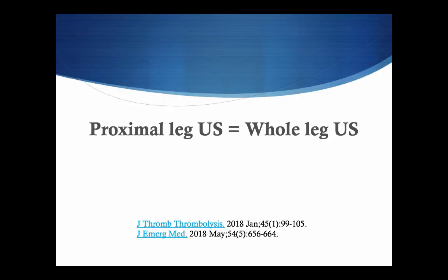It's pretty evidence-based. So one thing that both of these guidelines talk about is they don't differentiate a proximal leg ultrasound versus a whole leg ultrasound, and that's in vascular labs. Here, our vascular lab, they pretty much always do the whole leg. But in other vascular labs, it's not uncommon that their DVT study is just the proximal leg. So I think that's an important point to keep in mind when we're talking about what we do.